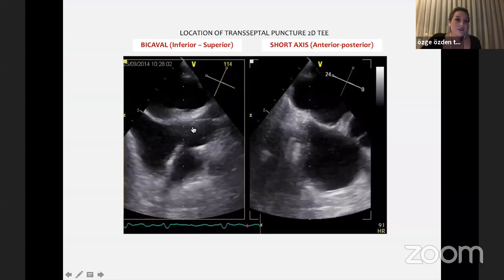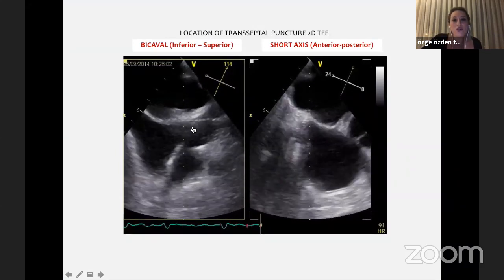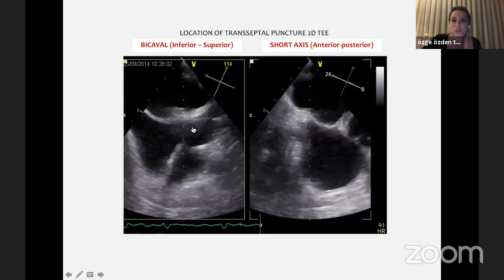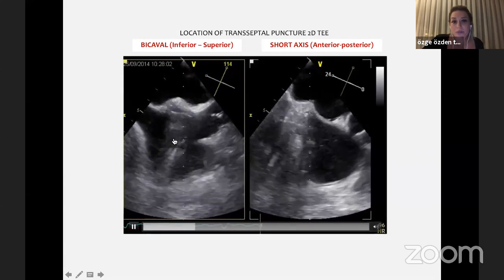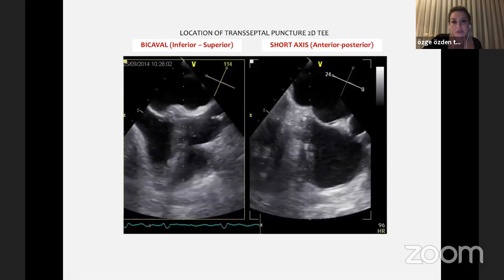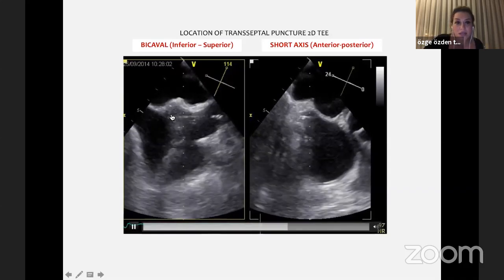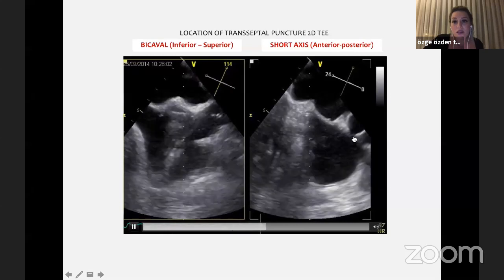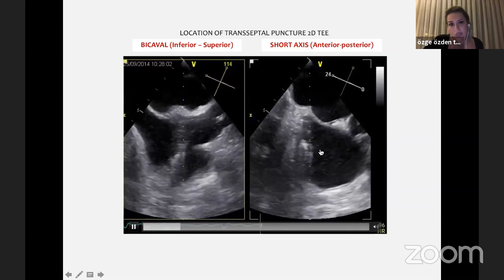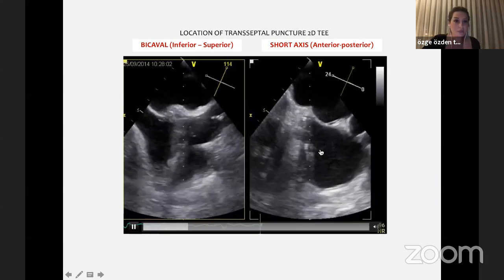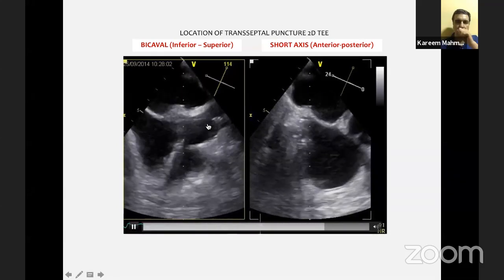Let's start with the steps of the procedure. The first step is interatrial septal puncture. We mainly use three images for this: the bicaval view, the short axis view, and the four-chamber view. In the bicaval view you can see the superior vena cava, interatrial septum, right atrium, left atrium, and inferior vena cava — we tend to be positioned more superiorly.